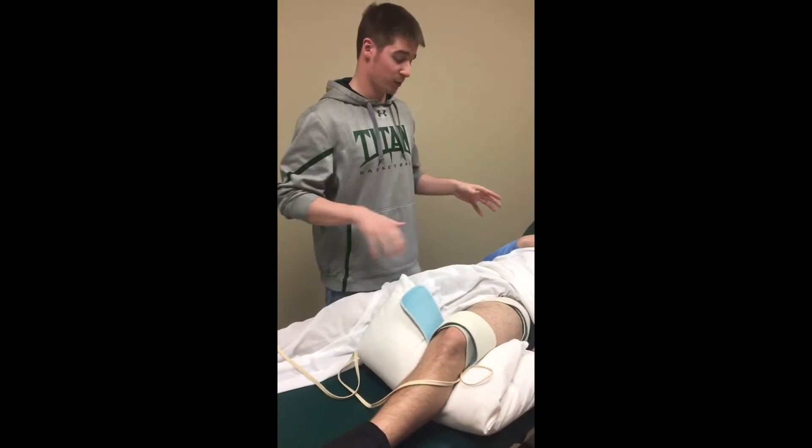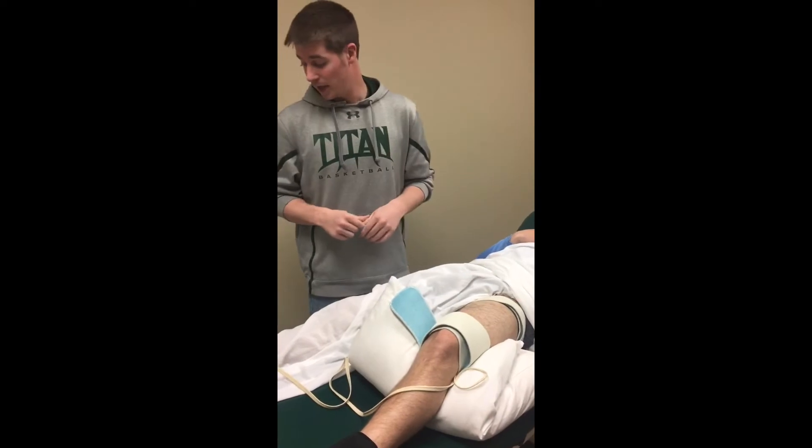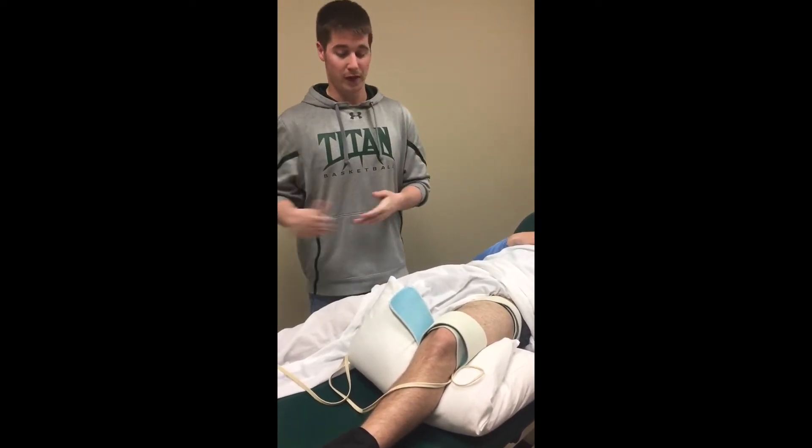We placed a weight here to hold the leg down. The patient was cleared of all contraindications, or else we would not have done this treatment, and we just wait until there's a contraction and then go from there with a 10-minute treatment.